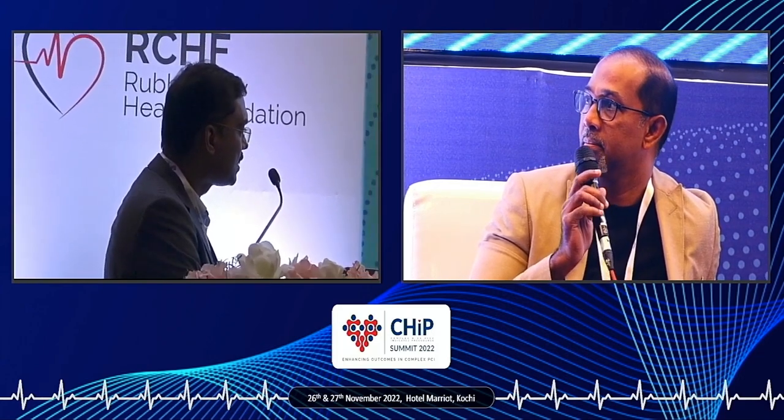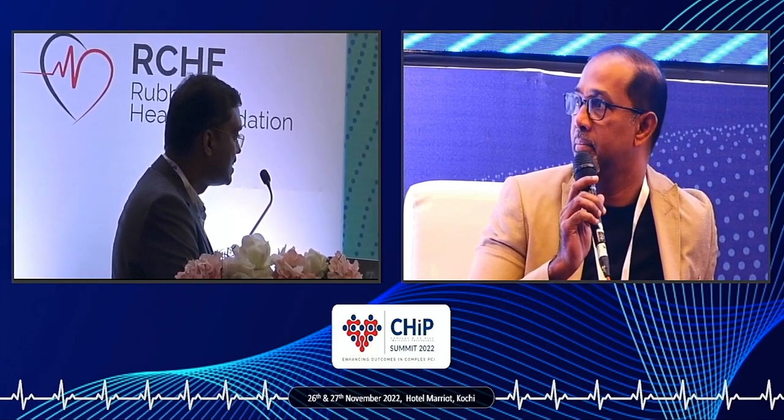And how do you select the fluence and frequency? As you rightly told, if it is within the stent, we can go straight away to 60, 60, 80, because we are safe. If we are dealing with the native vessel, I always go with 25. It depends on the lesion morphology. If there is thrombus, the laser energy will be absorbed much into the thrombus, so we can go higher, but always start lower and then go up. Whereas if it is a fibrotic plaque, you can go with medium. For very severe calcium, obviously, high energy.